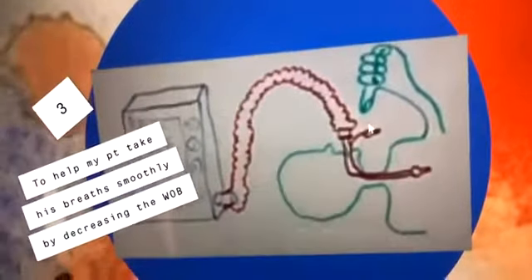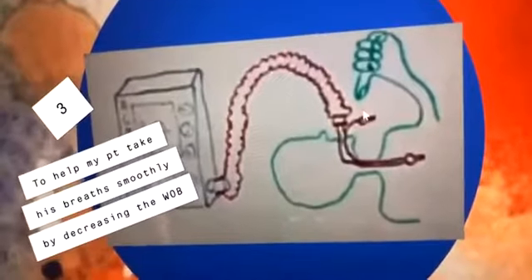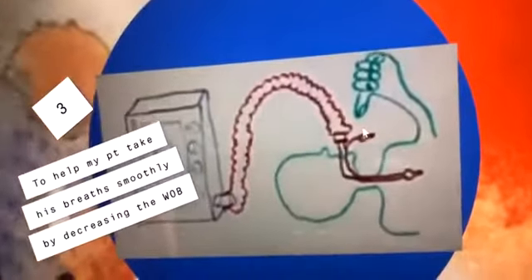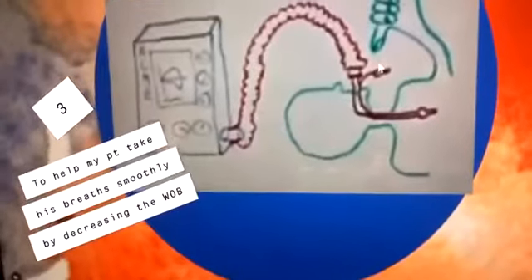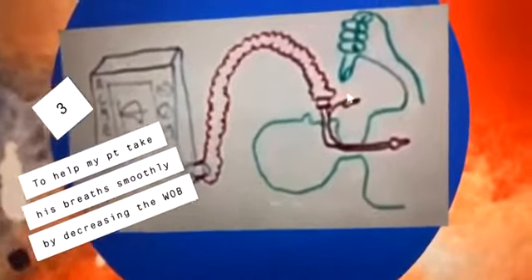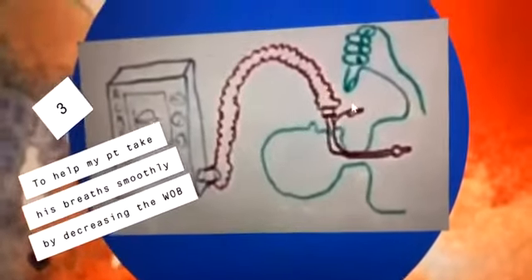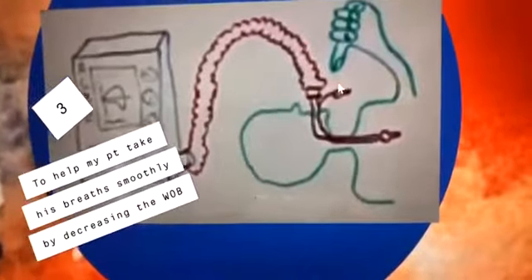So I'm going to add an extra flow and extra pressure to help take away some of the resistance that the patient has to breathe against. So the ventilator will not push or force the breath inside the lungs like it would in a pressure control mode. The idea is only to help the patient take his breath by adding a little pressure and flow.